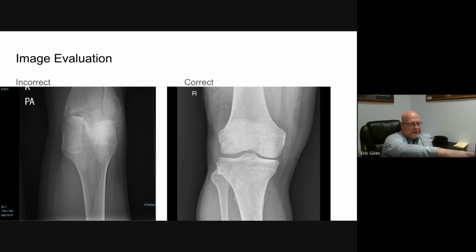So we've got our femur up and our tib fib down, okay? And we know that the fibula is on the outside, tibia is on the inside, right here, and it's marked with an R, okay? So looking at us, looking at the skeleton, looking at that image, we know that that's the right knee. We look at the one on the left, we can see that something's not quite right, and it's just upside down, okay? All right.